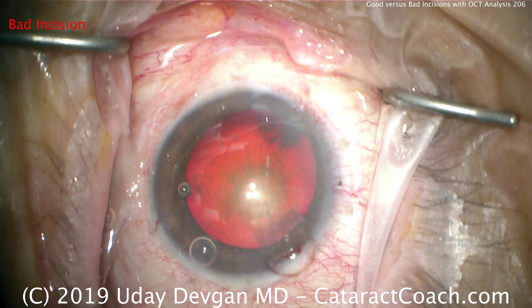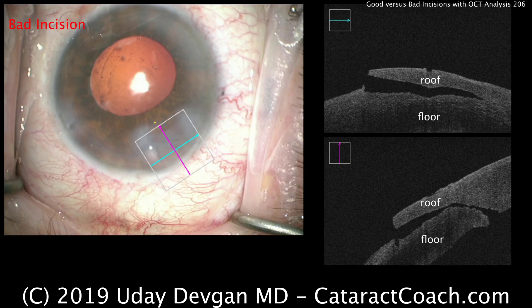Let's look at the OCT scan of this incision. On the OCT, you can see the floor and roof are not balanced — the roof is much thinner than the floor. The incision doesn't want to seal well, and the total length is too long.